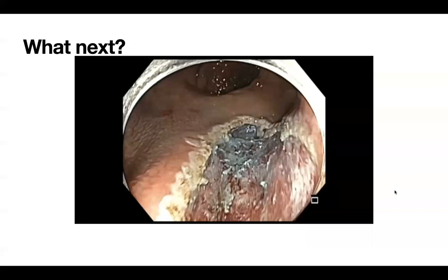So my learning point for this case, Raju, is that we should feel a little bit more emboldened to first examine the anal rectum carefully for lesions, smaller lesions than this, which will be easier to tackle than letting something get this large, and to be able to get some courage to actually try to remove some of these lesions. So that's my learning points.